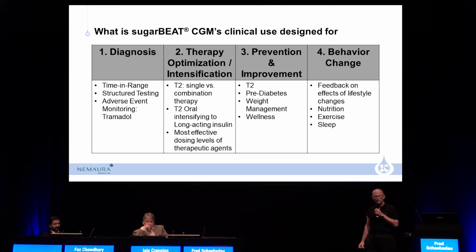Currently, the episodic test rate in this group is abysmal. It's very low. It might be 0.3, 0.4 test strips during the day. That's nothing. So Dr. Polonsky in California then developed something called structured testing for type 2s, where you conduct 7 tests a day times 3 days. The test is performed pre and postprandial, 3 meals, plus once before going to bed. Sometimes called the poor man's CGM, but nevertheless, there's a lot of time in between those meals where you don't have data. And with data, you can then make decisions.